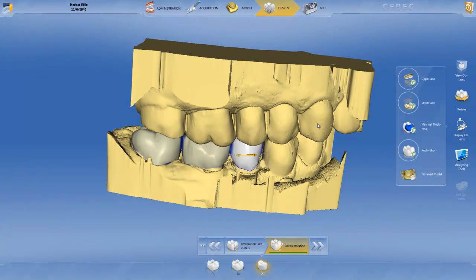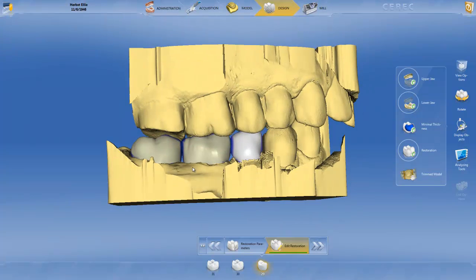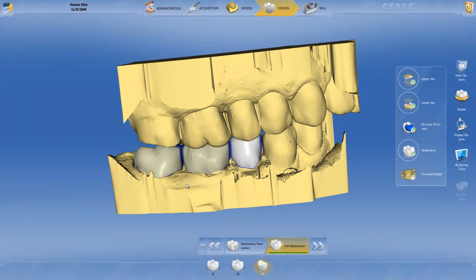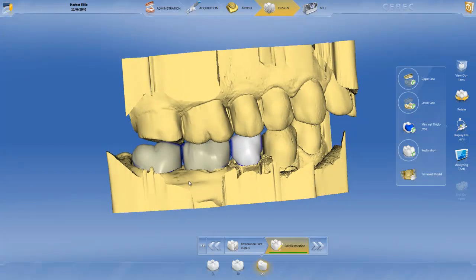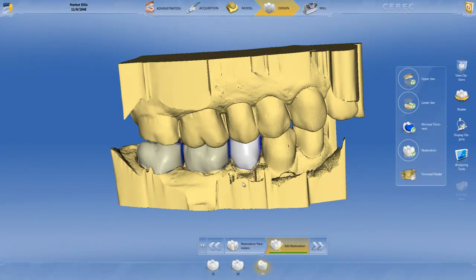At the end of my procedure, I'm gonna adjust number 2 crowns to make it even with the rest of the teeth. I should probably do it before I take the digital impression, and make the number 31 nicer. But I'm gonna take this into consideration and design my restorations.